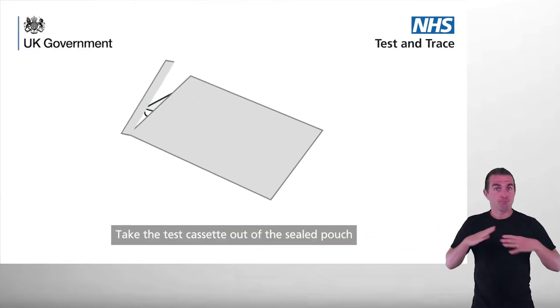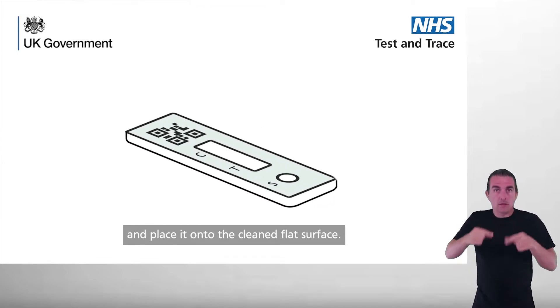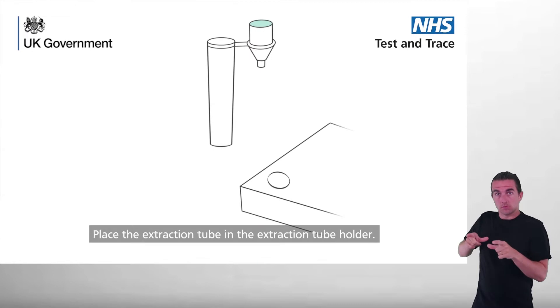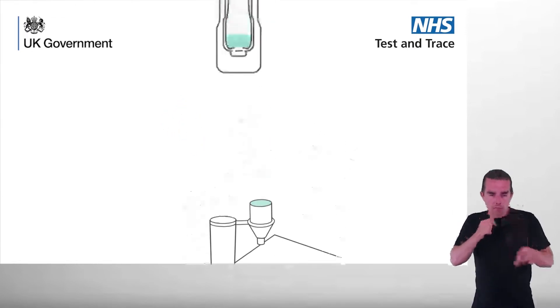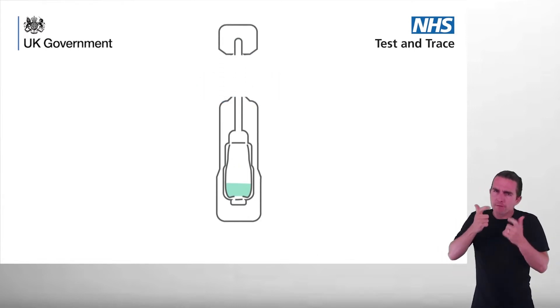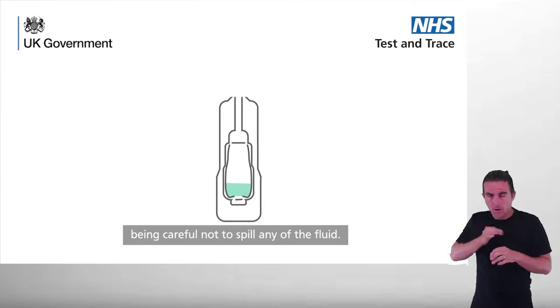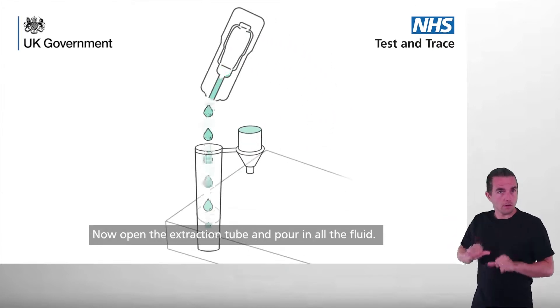Take the test cassette out of the sealed pouch and place it onto the cleaned flat surface. Place the extraction tube in the extraction tube holder. Keeping away from your face, carefully twist or snap open the extraction buffer sachet, being careful not to spill any of the fluid. Now open the extraction tube and pour in all the fluid.